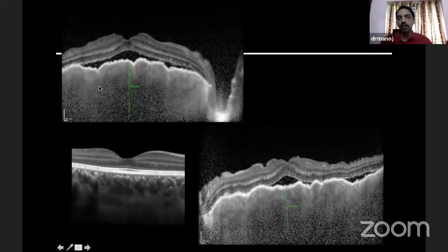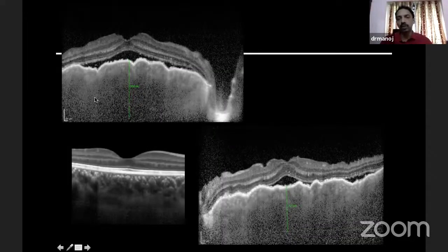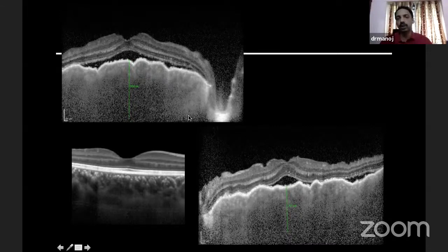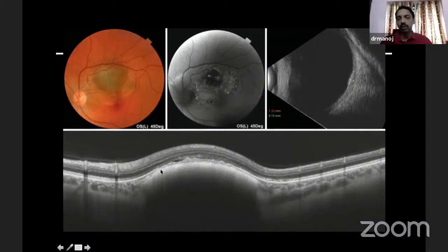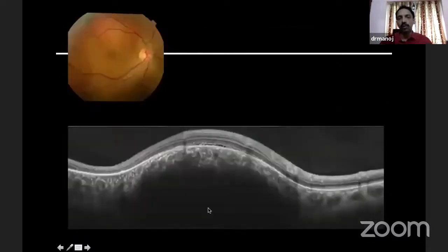In this patient, you see the whole choroid architecture is lost — you don't see the Haller's, Sattler's, or choriocapillaris layers; the architecture shows a lot of holes. This is seen in uveitic conditions. This is a patient with VKH who has this pattern. This is another lesion where you see a solid lesion blocking the light going through, with an almost smooth contour — this is an example of choroidal melanoma. In choroidal hemangioma, on OCT you see a lot of blood vessels still preserved amongst the tumor, and that helps differentiate choroidal melanoma from hemangioma.